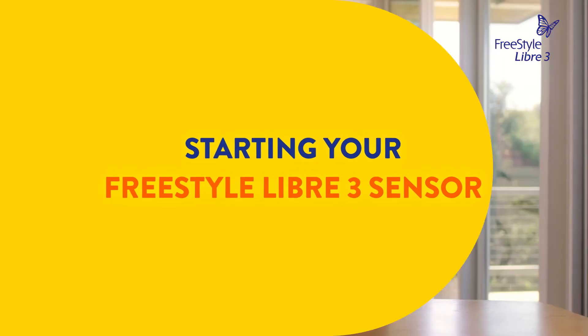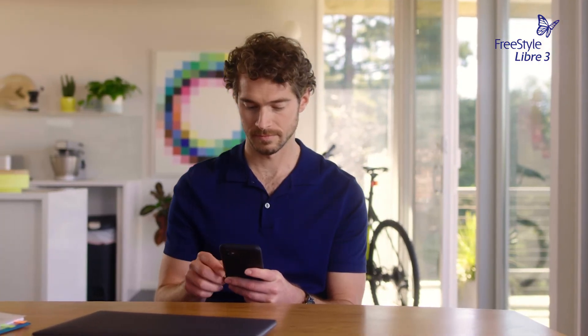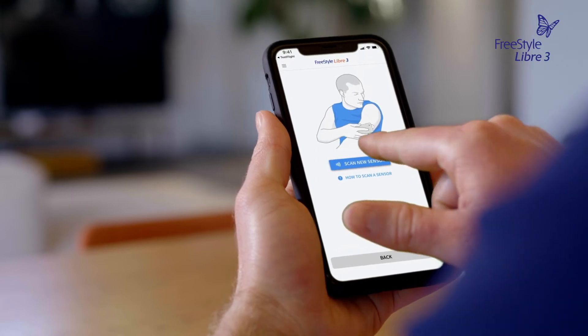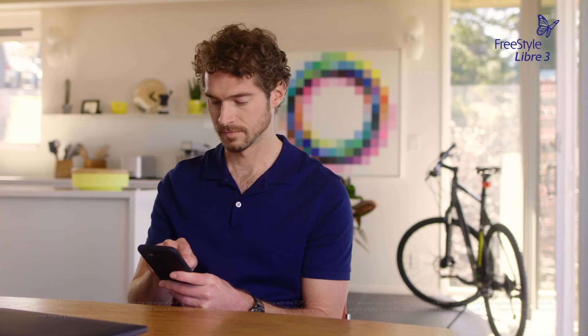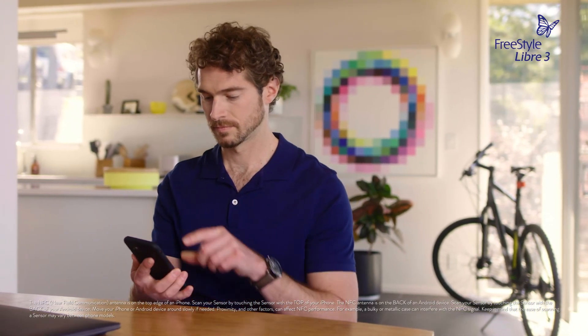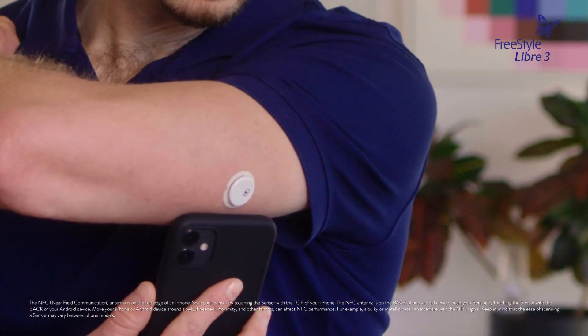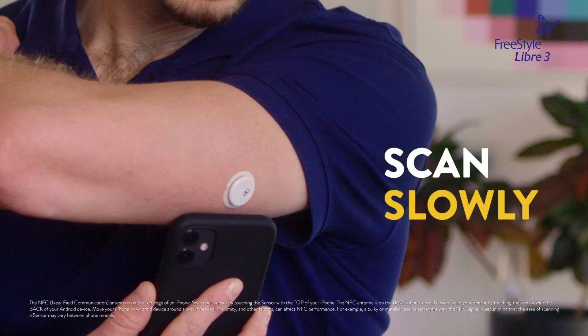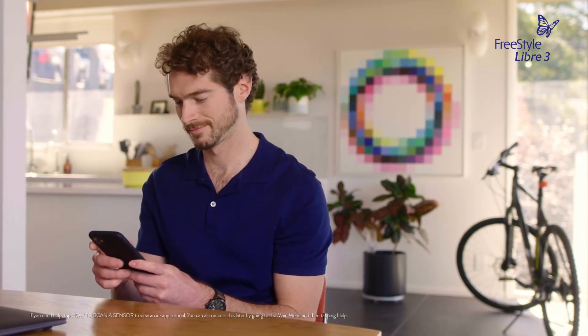To start a new sensor, you'll need to scan it with your smartphone. From the app home screen or from the app's menu, tap Scan New Sensor. Your phone is now ready to scan the sensor to start it. Touch the sensor with the top of your phone slowly. Things like proximity, orientation, and phone cases can affect scanning. If needed, slowly move the phone around.